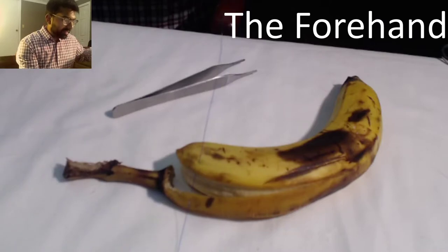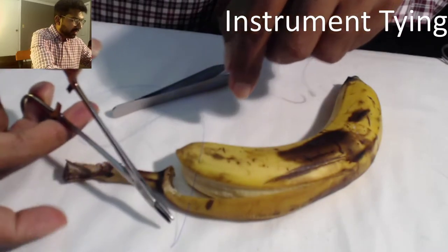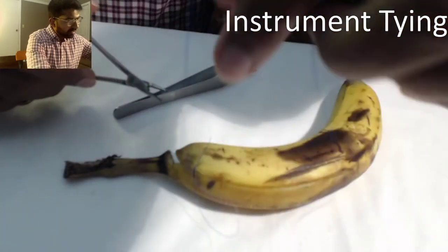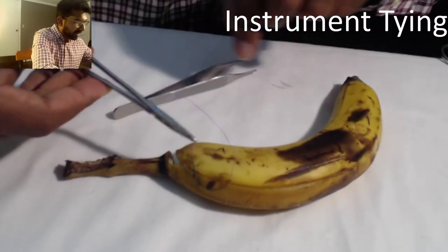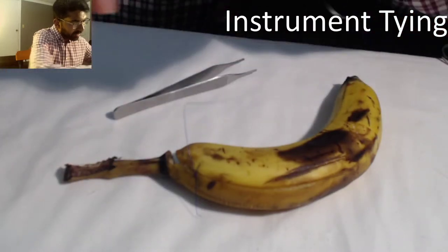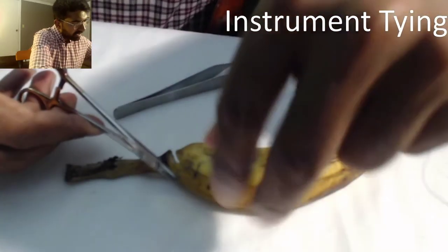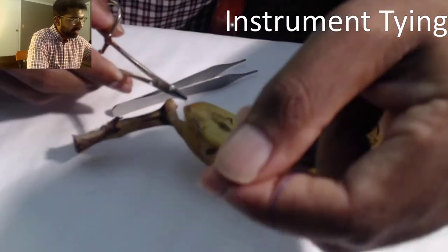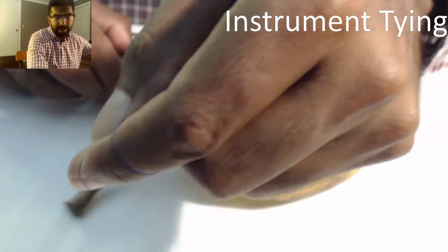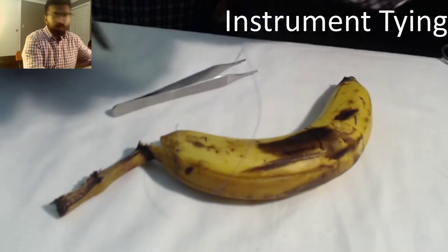Going back to the basics from a video a long time ago, I'm going to instrument tie this, working inside the V, grabbing the tip of it, crossing my hands, and the knot comes down square. Again: working inside the V, grabbing it, crossing my hands, knot comes down square. Now if I tie too hard or pull up on this, as the banana peel gets more ripe there's a chance it'll rip right through. That should give you a sense that you're putting too much weight pulling up when you want to bring the needle down.